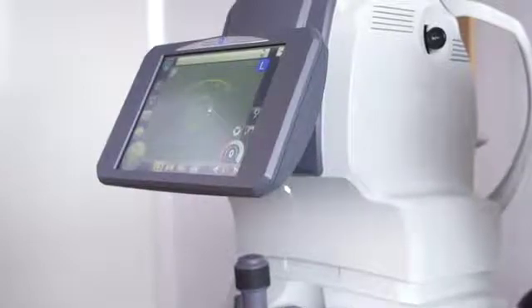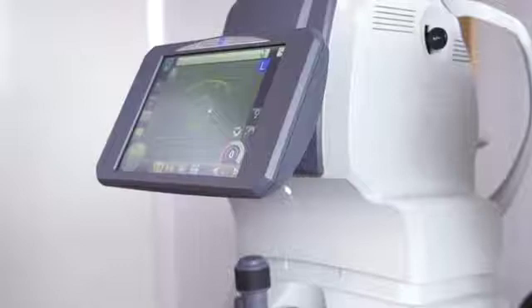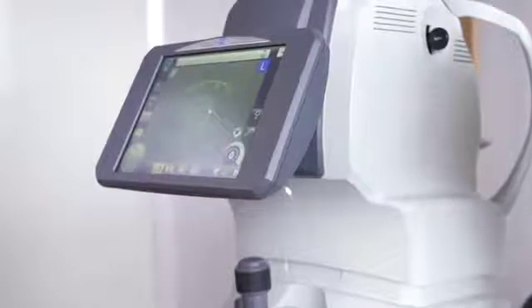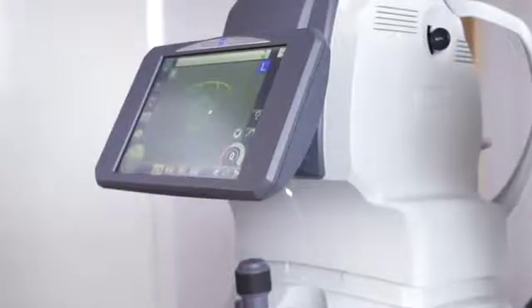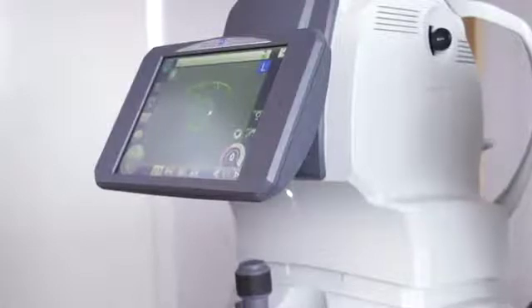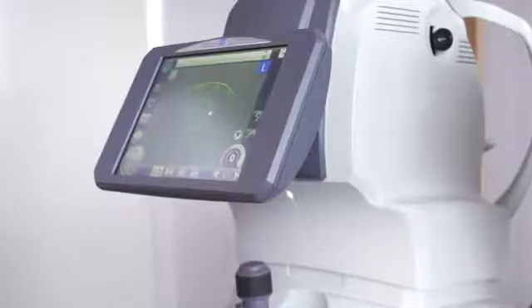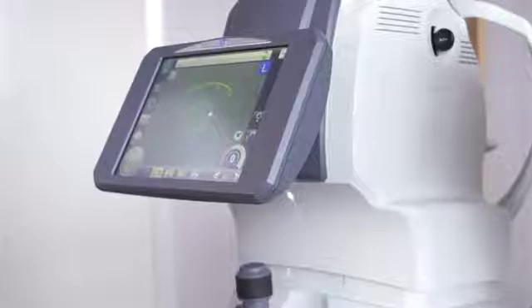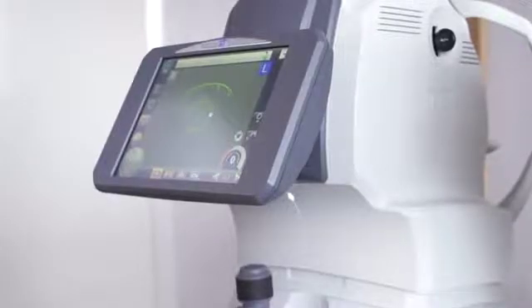The AFC330 can be used as a standalone device, connect to an external PC to use NIDEK's Navis X software, or can integrate into various practice management systems. It is fully diabetic screening accredited in the UK and has the ability to produce panoramic and anterior eye photos also.